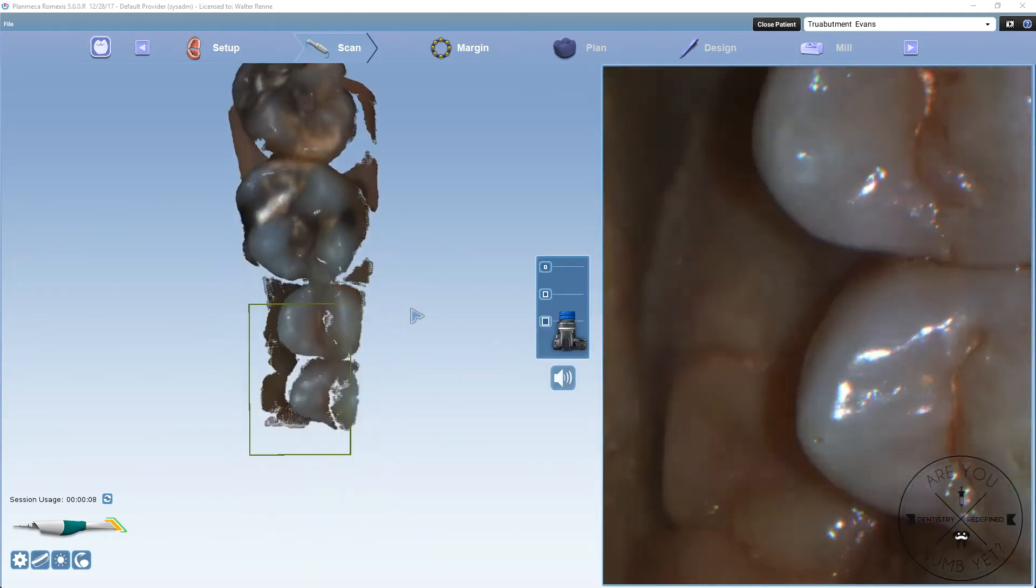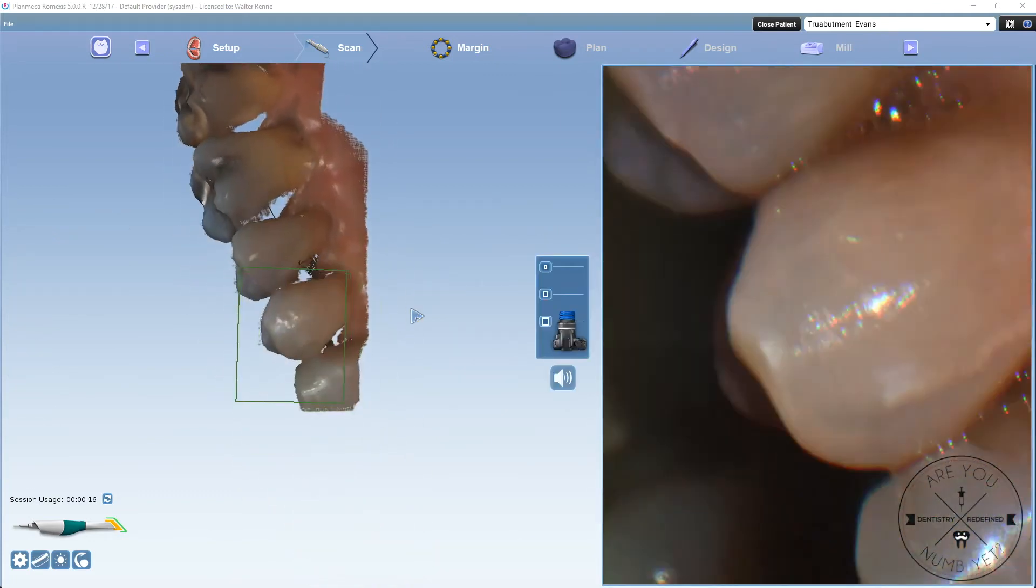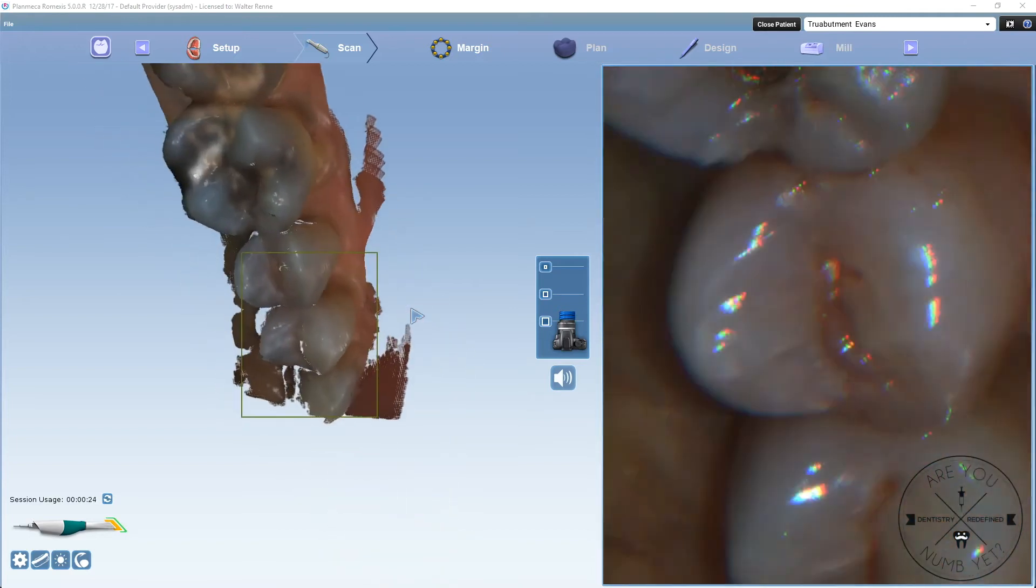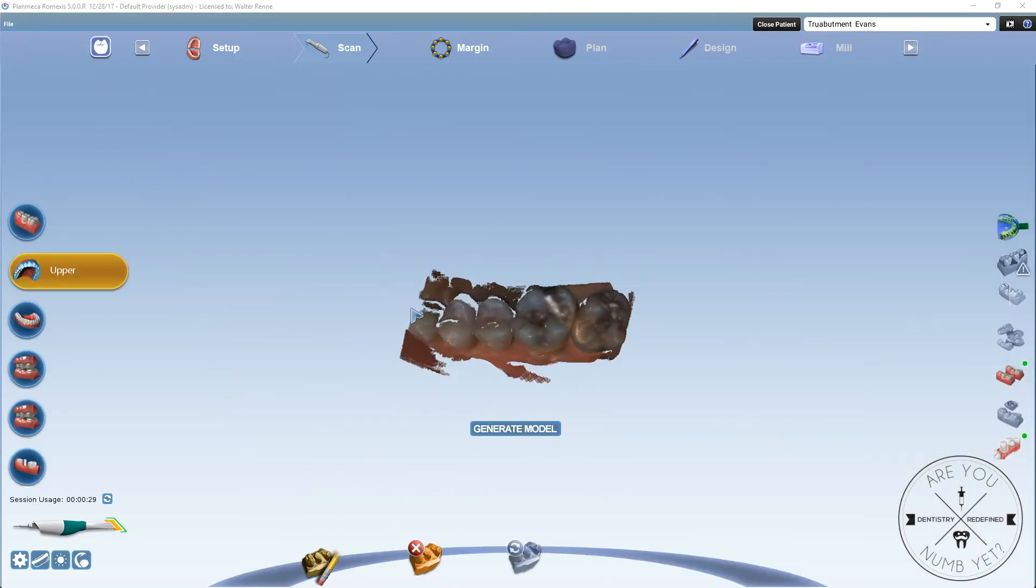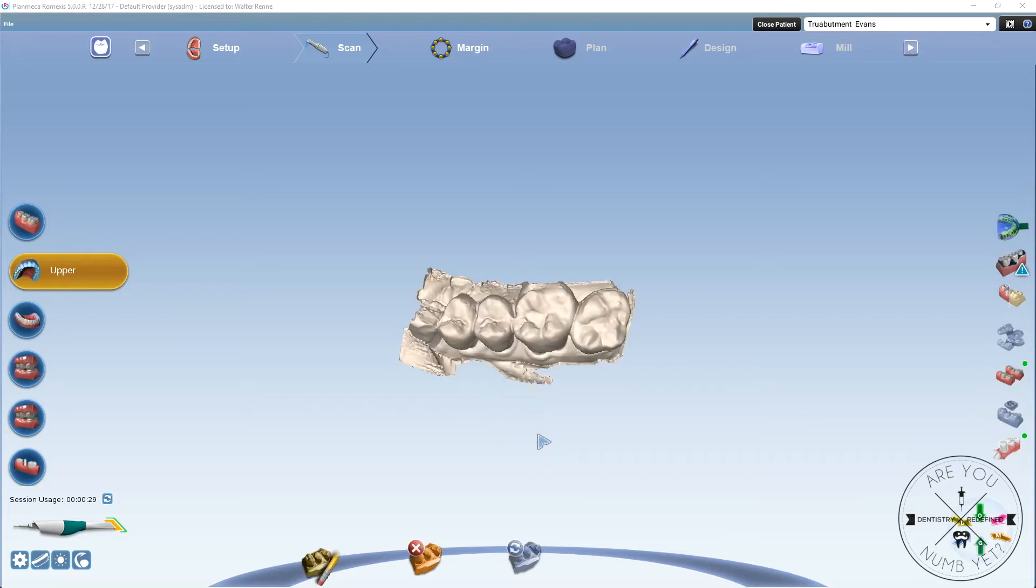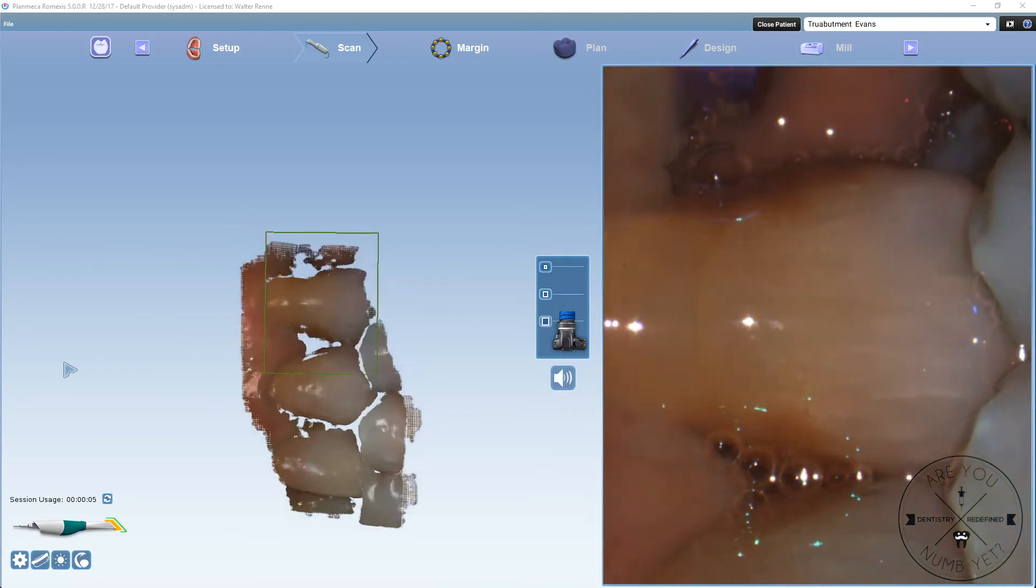And then next, you're going to scan the opposing. You don't really need a whole bunch for that. You just need the occlusals and facials because this is going to be all digitally designed. Nothing's even going to be printed for this part, so you don't have to necessarily worry about filling in everything.